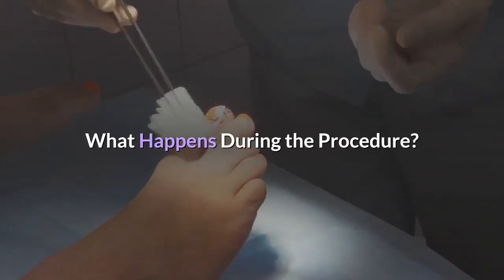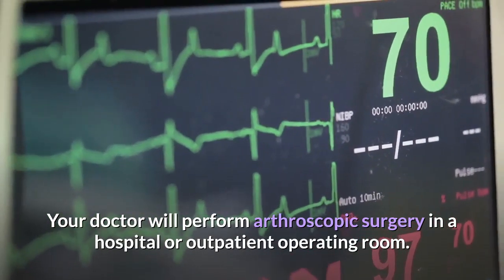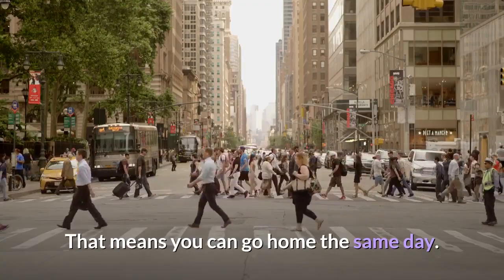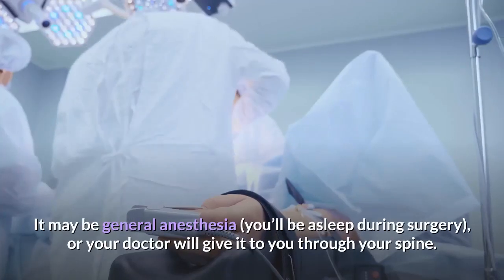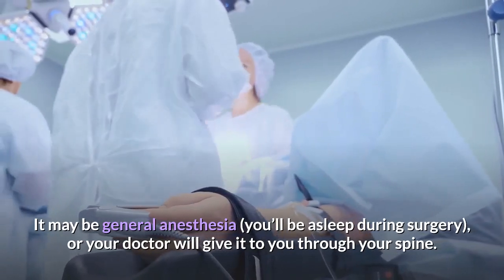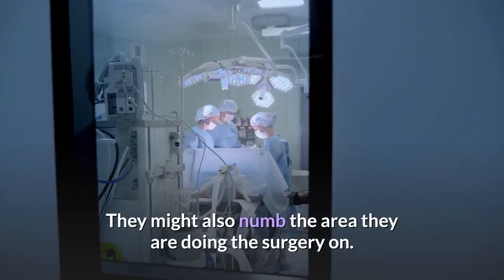What happens during the procedure? Your doctor will perform arthroscopic surgery in a hospital or outpatient operating room, which means you can go home the same day. The type of anesthesia you'll receive depends on the joint and what your surgeon suspects is the problem. It may be general anesthesia — you'll be asleep during surgery — or your doctor will give it to you through your spine. They might also numb the area they are doing the surgery on.